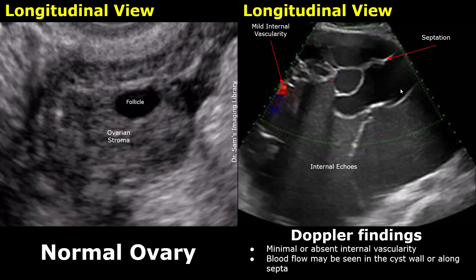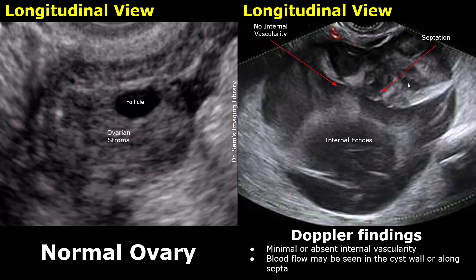Blood flow may be seen in the cyst wall or along the septa. Here is another case of a mucinous cystadenoma. Doppler is applied here, but we do not see internal vascularity within the mass. This suggests that it is a benign mass. The other features that suggest it is a mucinous cystadenoma are the presence of internal echoes, internal septations, and a smooth round shape and contour.